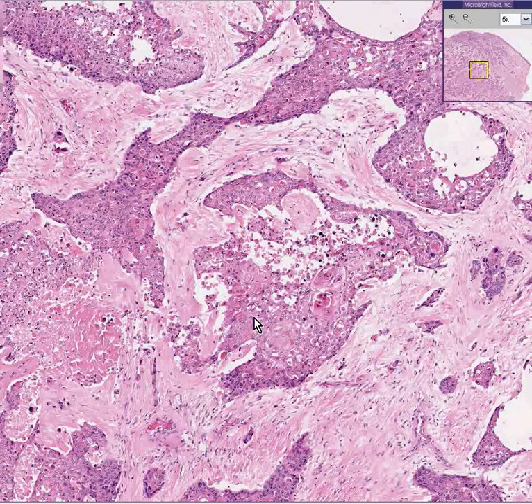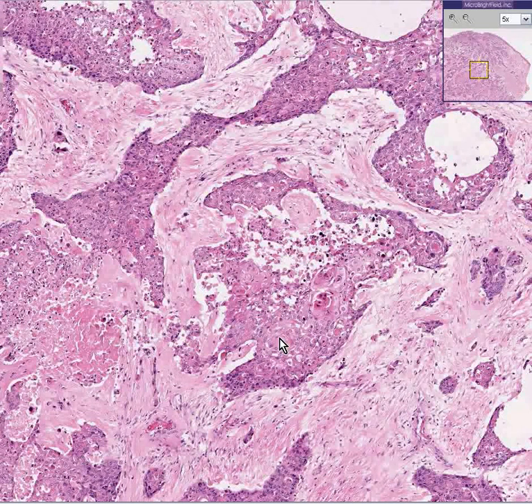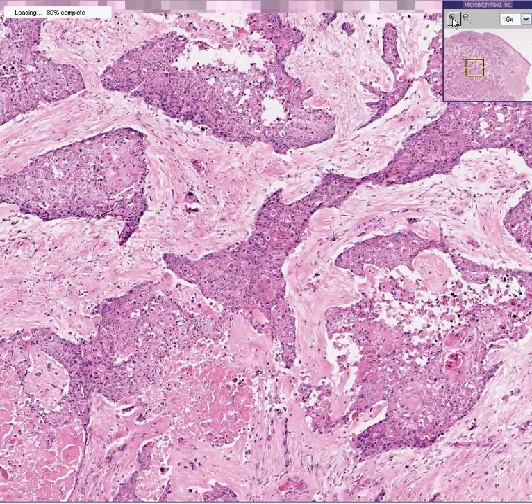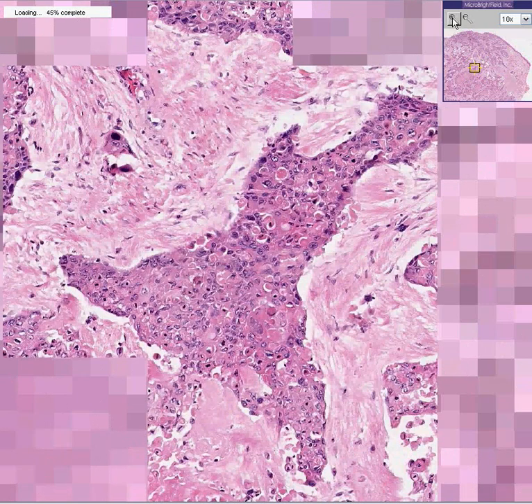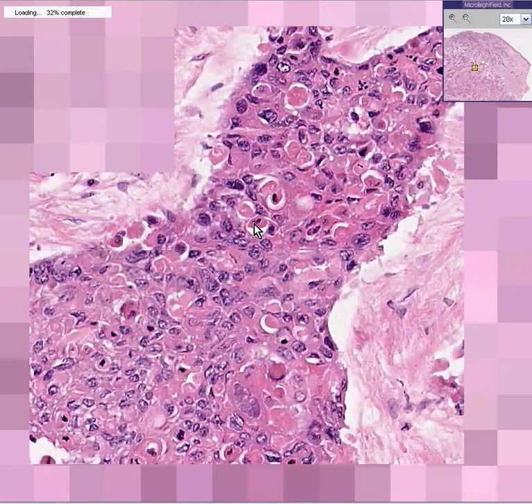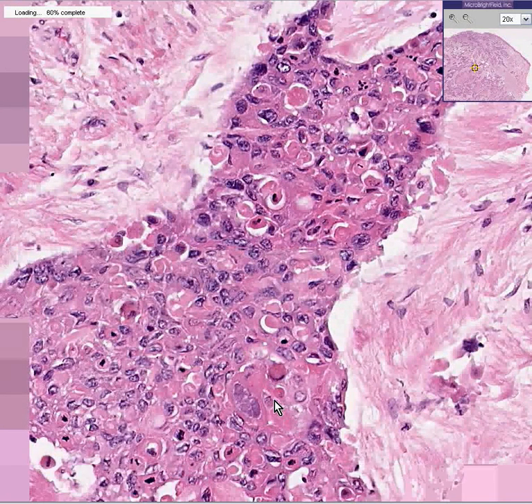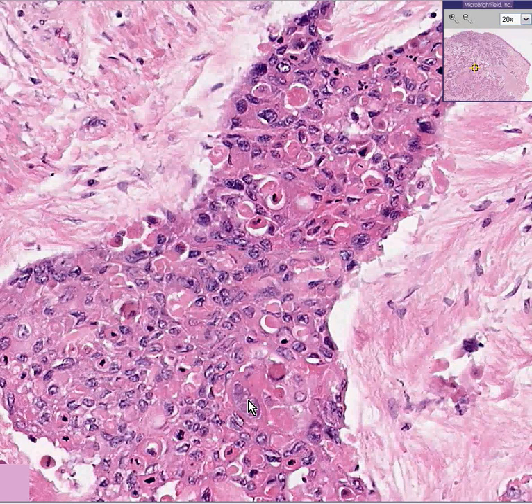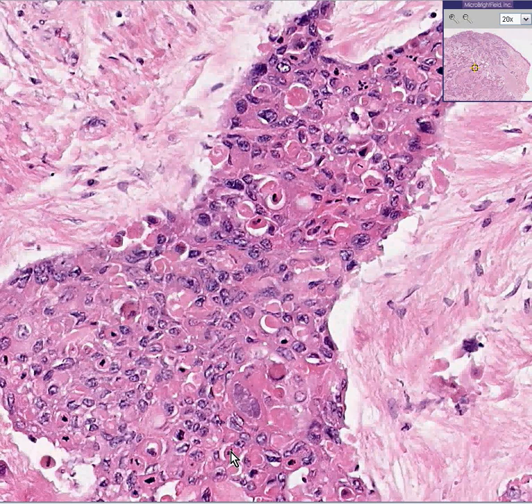Going to high power, we can see the nastiness of the individual cells. We can see these little orange areas representing keratinization here and here and here. And we can see some big, nasty, ugly, pleomorphic, hyperchromatic cells — here's the nastiest one. Here's one in mitosis, here's a mitosis, here's a mitosis, and probably one here. So even if this was the only thing we saw, we would suspect it is a very pleomorphic squamous cell carcinoma.